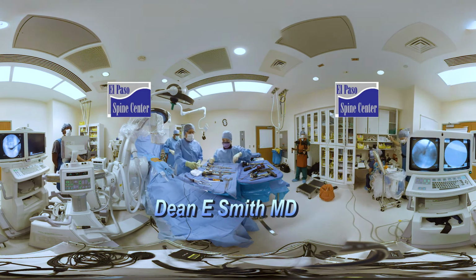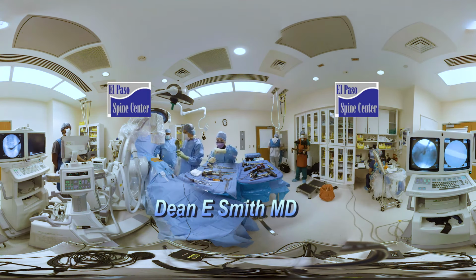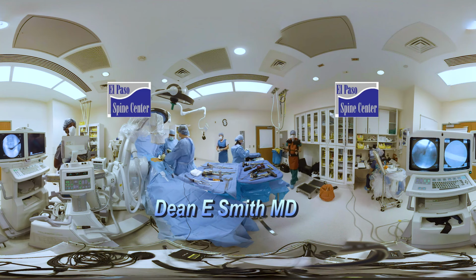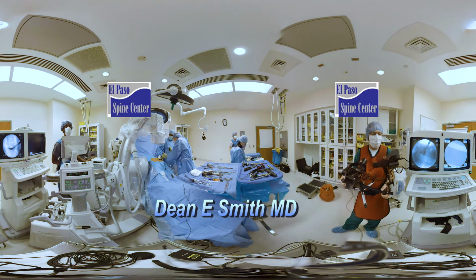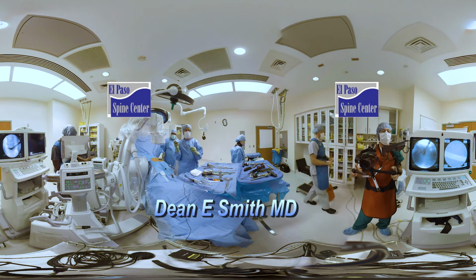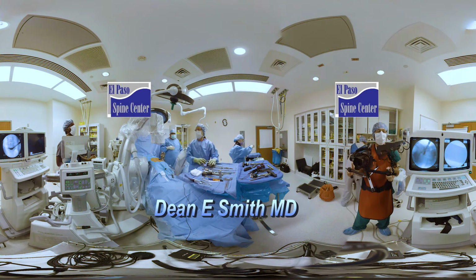Okay. We got the bone graft to put inside and the plunger. So this is a mixture of bone graft and stem cells that we're putting around the balloon. And a little bit of pixie dust. Yeah, Memo brings the pixie dust.